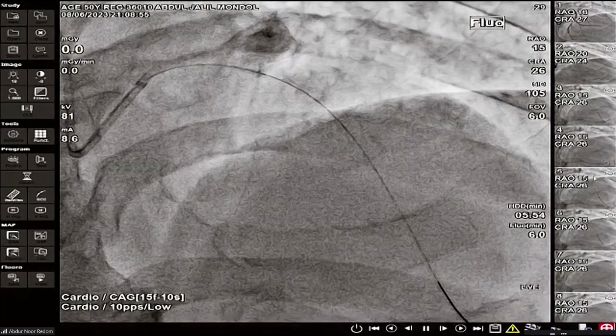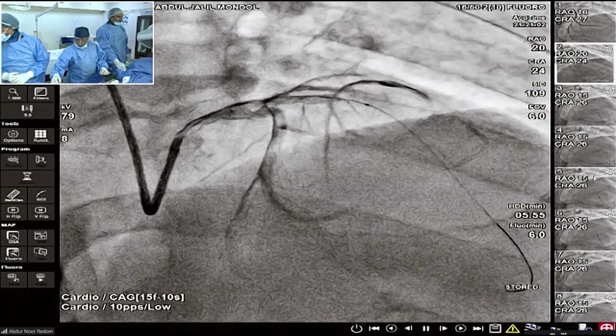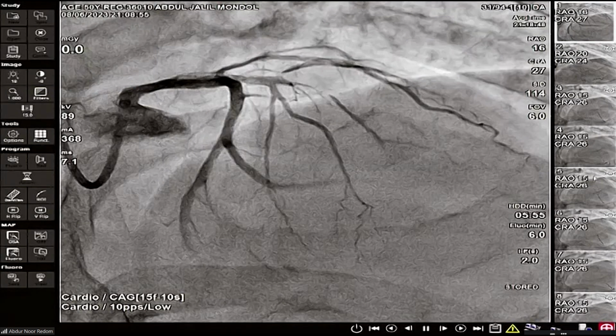So I have one question regarding the CTO, Dr. Guzman. Like this was a CTO, so the distal vessel is underfilling, and after some time that vessel may dilate. So it looks to be 3 millimeter now, with a 2.5 balloon. Does it accommodate 3.25 or 3.5? That's the reason why you do the IVUS, but you are correct. Many of these vessels will grow. If the vessel is in spasm, then IVUS will measure the spasmed vessel only. So it is correct that you probably will under expand if you follow this.